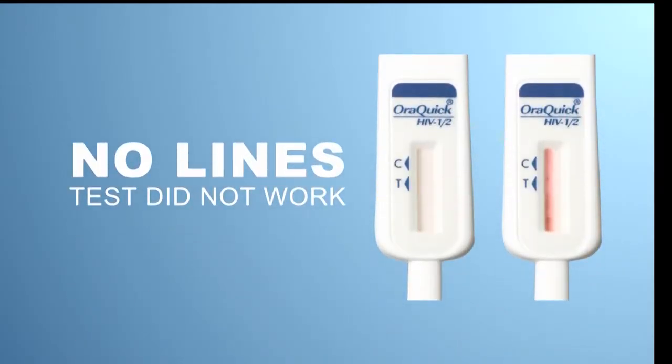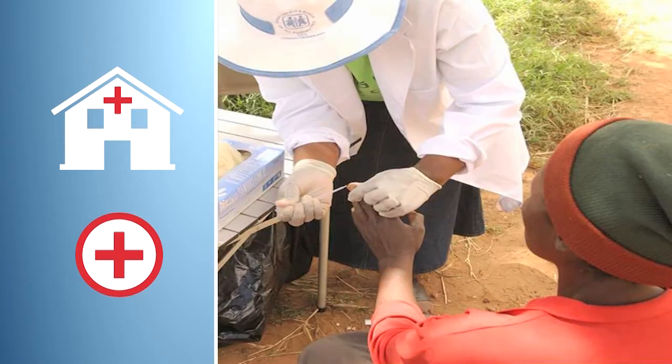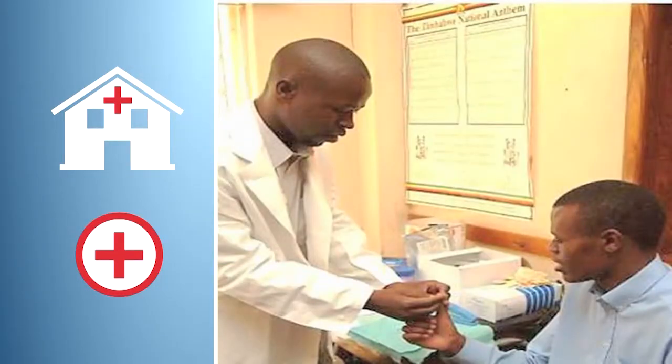If you do not see any lines, then the test did not work properly. Visit your nearest HIV testing center or health facility to test again.